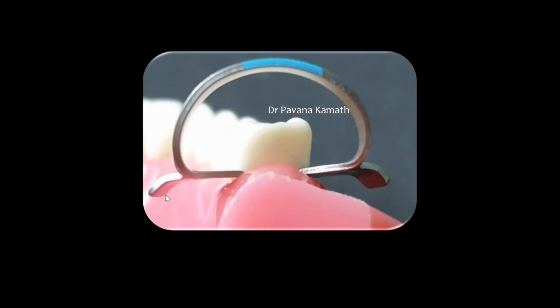Now, wingless clamps and winged clamps are great for beginners who are just learning how to perform isolation. So when I give you the demonstration, I will show you how easy it is to perform isolation with a winged clamp. Now, another thing about clamps that you have to know is passive clamps and active clamps. Now, you can see here, this clamp, it has a bow and it has jaws.